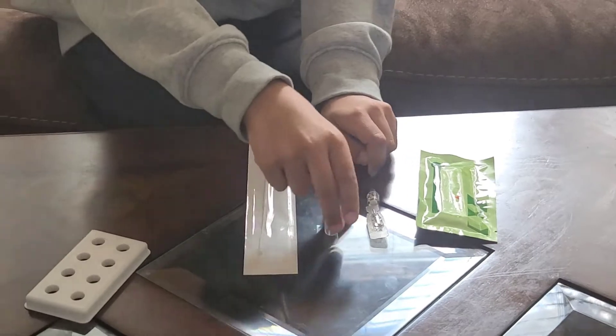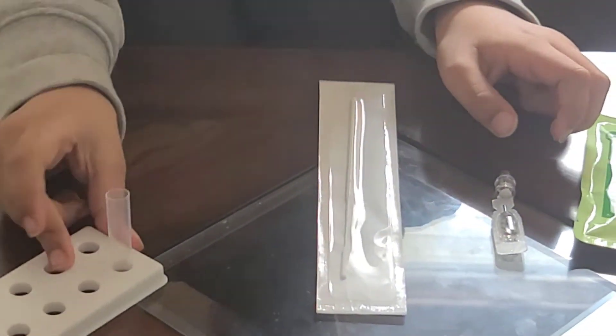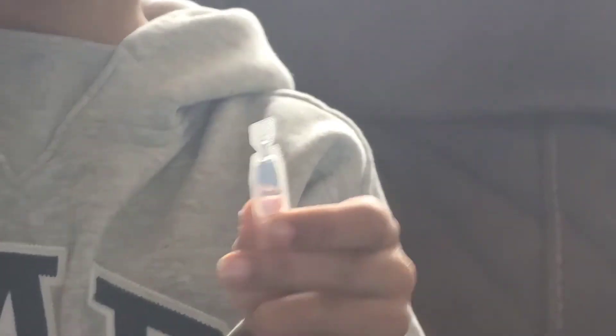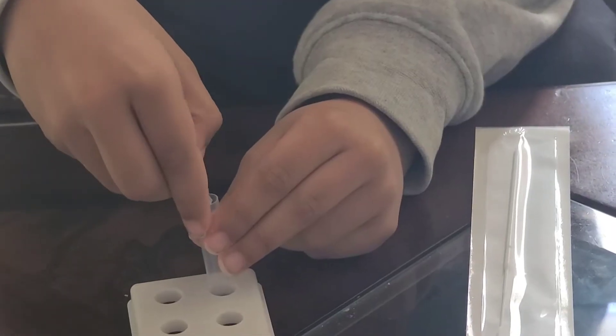After using it, you put this right over here. As you can see, there's a small capsule and they leak inside. You put it inside the liquid. Be careful.